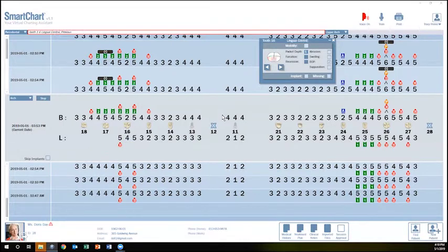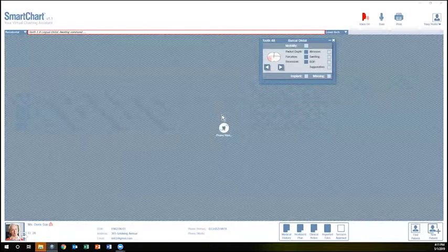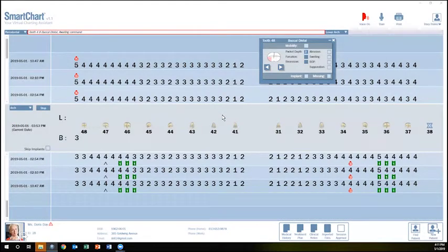Previous, previous, bleeding. Next, next, next, next. 4, 4, 4. 4, 3, 3. 3. 3, 4. 4, 4. SmartChart pause.